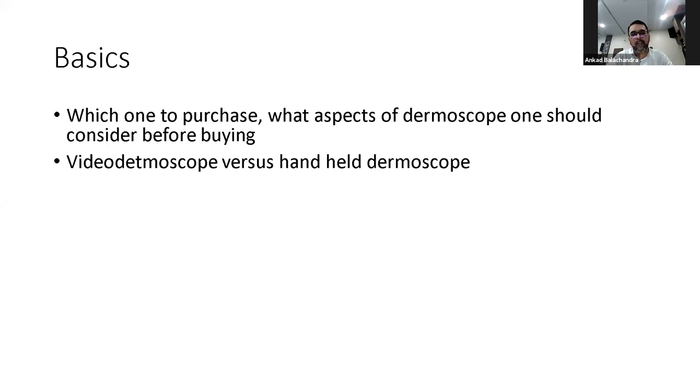And video dermoscope, there are many brands in India, but you should buy a good one. And handheld dermoscope also, there are two main brands in India, so we can purchase those. For the residents, it depends on whether they take a hair-related thesis topic or a skin-related one. But a handheld dermoscope can also do better study on hair disorders as well. So thinking of the future, one should go for a handheld dermoscope, so it will help both in their future consultation.